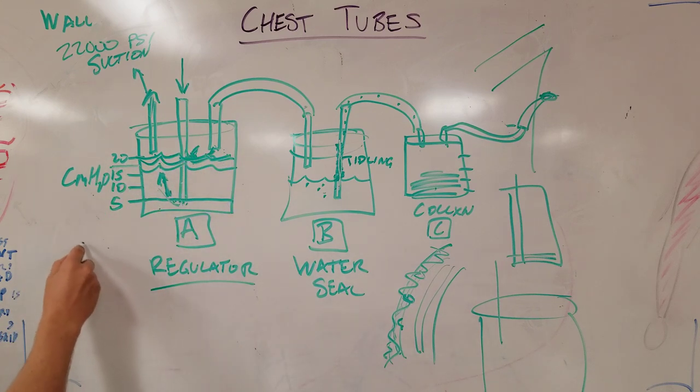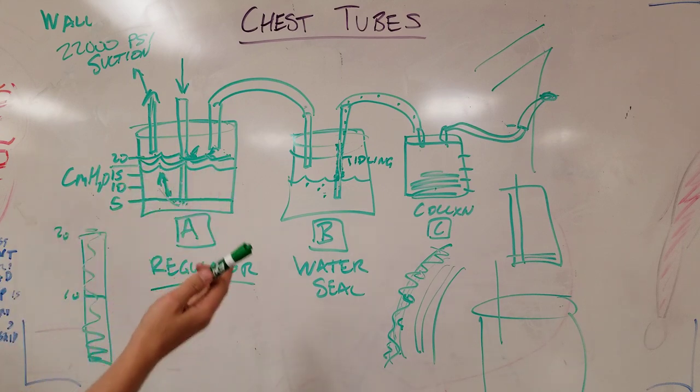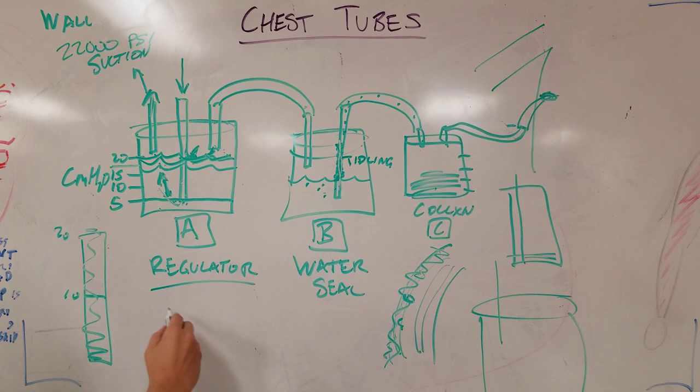And it's no joke, a column of water like this. This is approximately 20 centimeters. This would be like 10. This would be like 20. And we fill this all up with water, and that's the system that we have to overcome to get the ambient air. That means that the chest has seen 20 centimeters of water suction before we switch over to ambient air decompression. This would be classically a wet vac because we're putting water in here or saline in here, it doesn't matter. And for some of the geeks in the room, they might know the difference between a wet and a dry vac. But just by schematic, this is what you need to know to understand how a chest tube works.